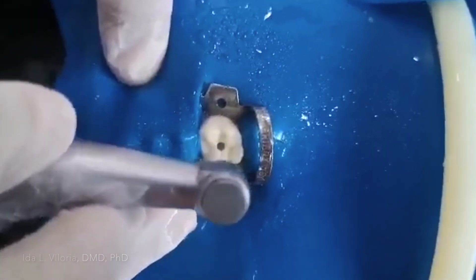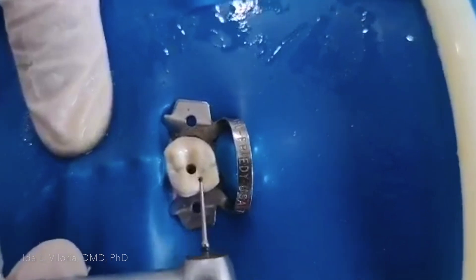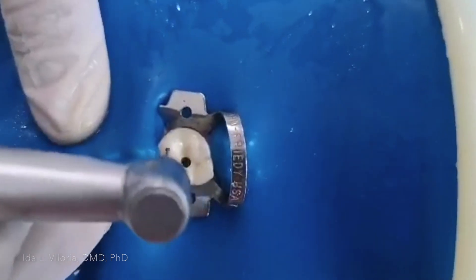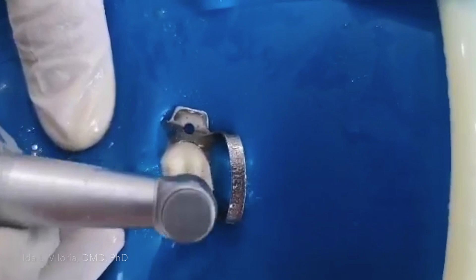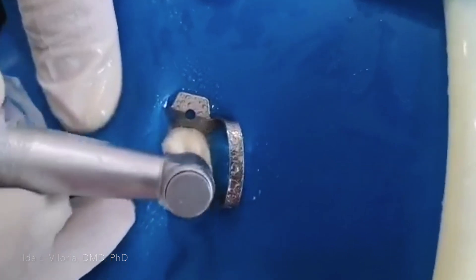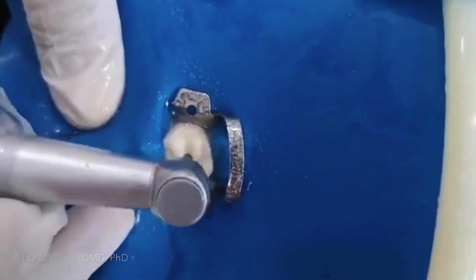That's the drop. Once you've felt the drop, I will still continue using the same round burr with an in-and-out motion, going towards the buccal, and then the palatal, and also mesial. I'll continue this until I feel that there's no more touching.